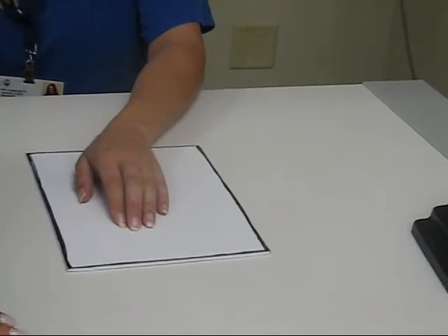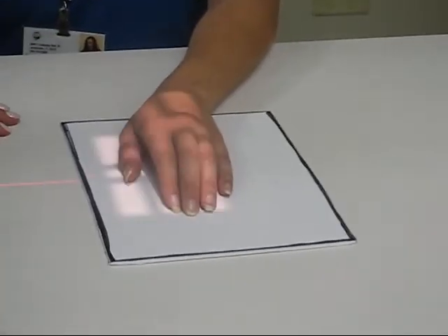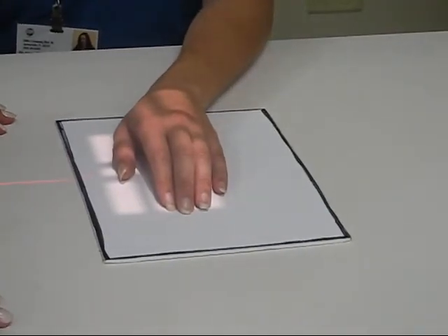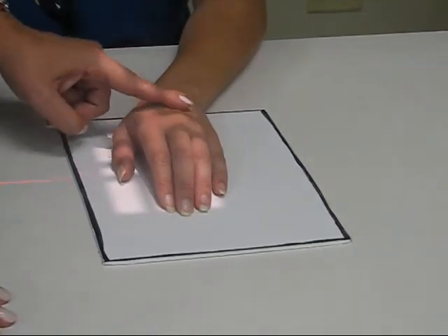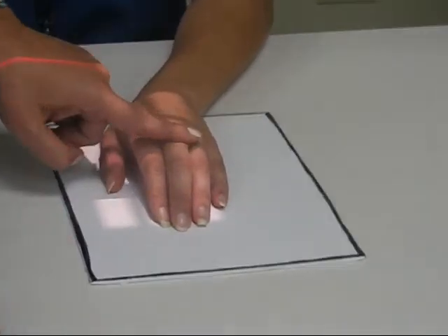For most wrists, an 8x10 size cassette is just fine. The thing that is really important with the wrist is that you maintain the alignment between the forearm and the hand.